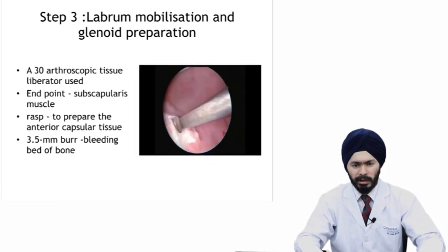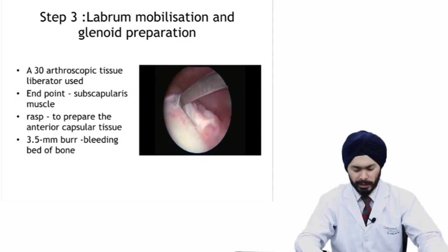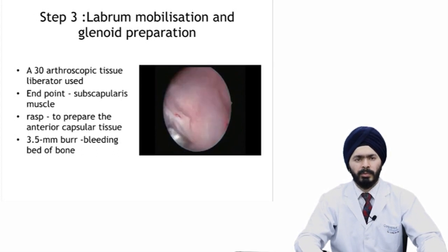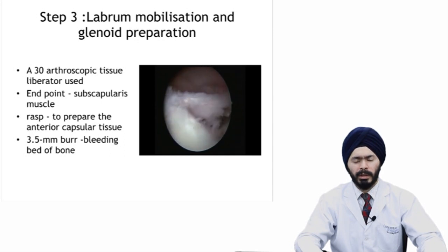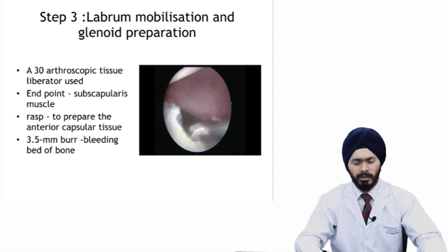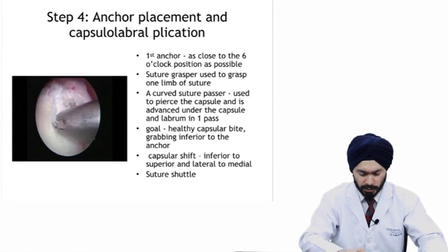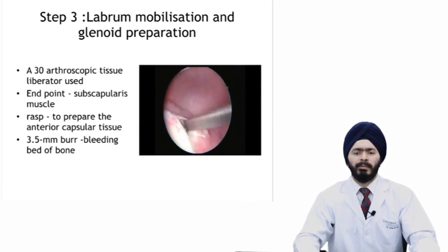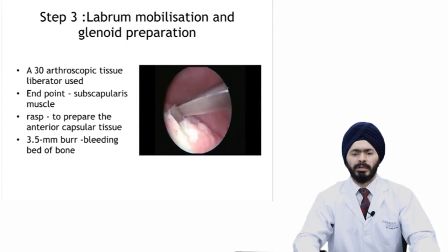When diagnostic arthroscopy is done, you move on to the next step: labrum mobilization. At this point, the antero-superior portal becomes your viewing portal and the antero-inferior portal, just above the subscapularis, becomes the working portal. From the working portal you insert a liberator. You can see instrumentation going from the antero-inferior portal. I'm viewing from the antero-superior portal — this is a liberator or periosteal elevator going between the displaced torn labrum which has malunited on the antero-inferior aspect.